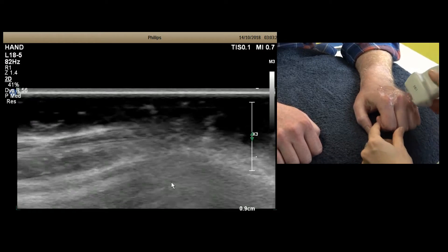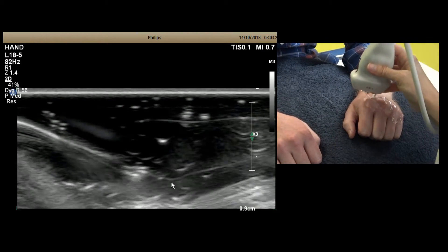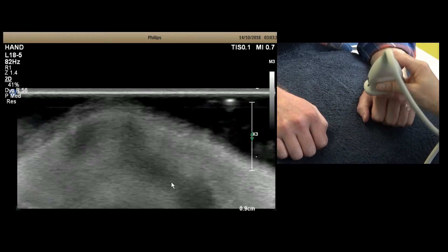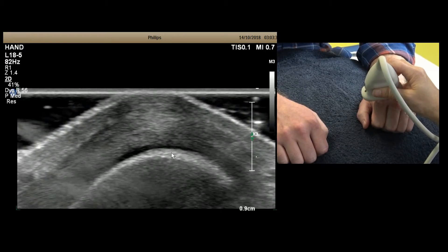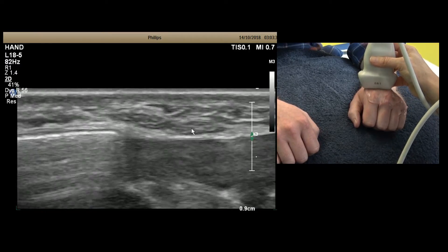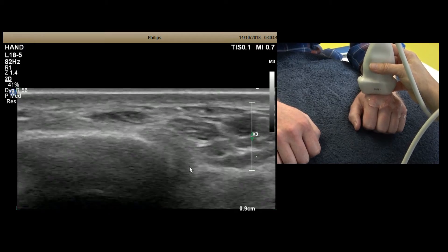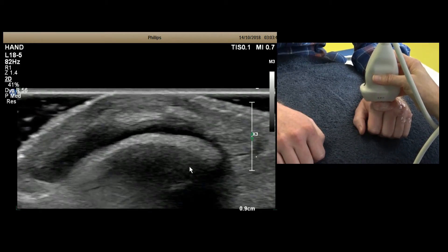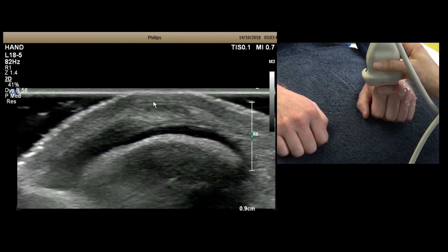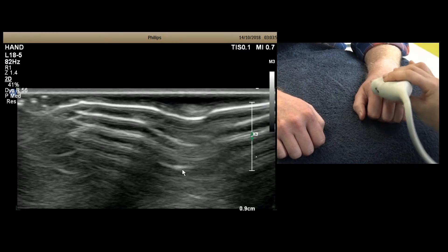Bear in mind that when assessing the index finger there are two tendons to assess. Keep a big pile of gel there as a standoff, and as you go back up the dorsal hand you can see both tendons — one here and one here — coming down, blending into the extensor hood. The sagittal band is here underneath and also wrapping over the top of the tendon. That's the boxer's knuckle assessment.